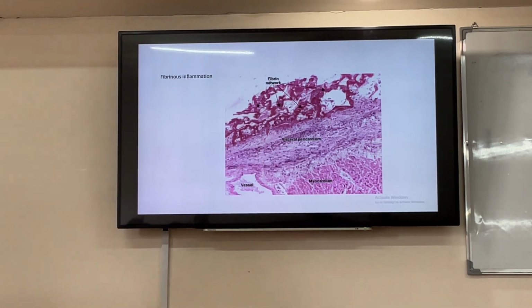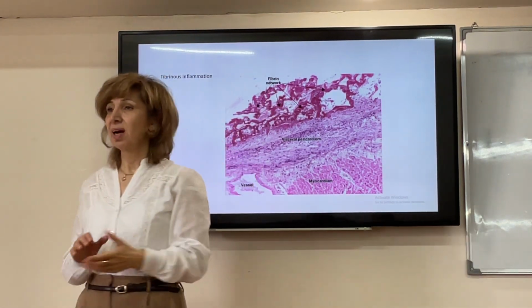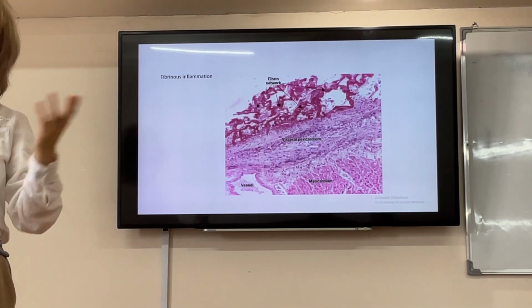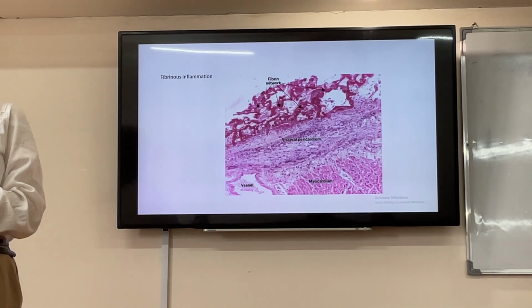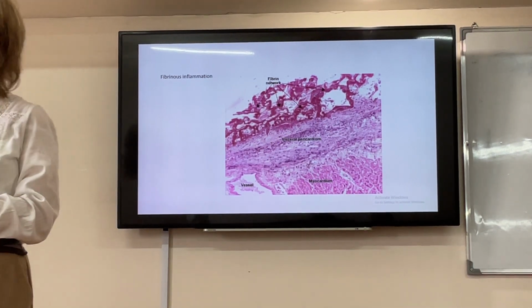What is this? What is this, fibrin? How does it look? I can continue. Give me an example of fibrinous inflammation. Tell me examples. Pericardial. Okay. Now I will add: there are certain bacteria that cause a special type of fibrinous inflammation. What are they? Tell me.